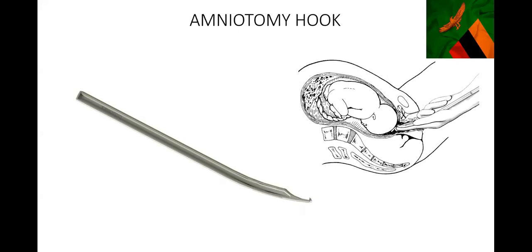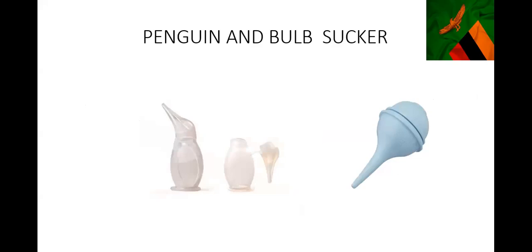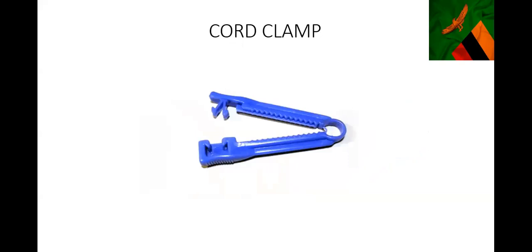Here is an amniotomy hook. In the labor ward we keep using wrong instruments, but this is the correct instrument for artificial rupture of membranes. Sometimes you can use a Kocher's forcep to rupture membranes, but this is the correct instrument when a woman is in labor and you want to do ARM for various indications. We know the penguin sucker and suction bulb, all used for neonatal resuscitation. The cord clamp should be applied three to four centimeters from the point of insertion.